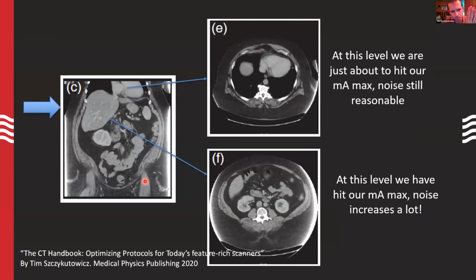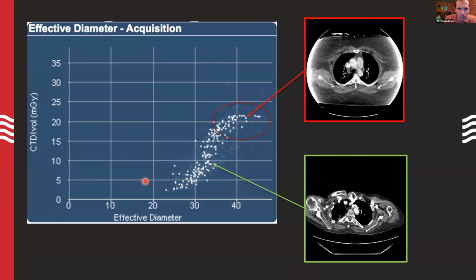But additionally, if it's a more foreign concept to think about this across different patients, I think especially if there are any radiologists in the audience here, it's a lot easier to think about within one patient, right? Everyone can scroll through one patient and see the size change, and know that usually you can see some kind of readout for what the scanner AEC is doing, and you can appreciate big differences in the patient size there, and then the mA correspondingly adjusting up when we get bigger sizes.